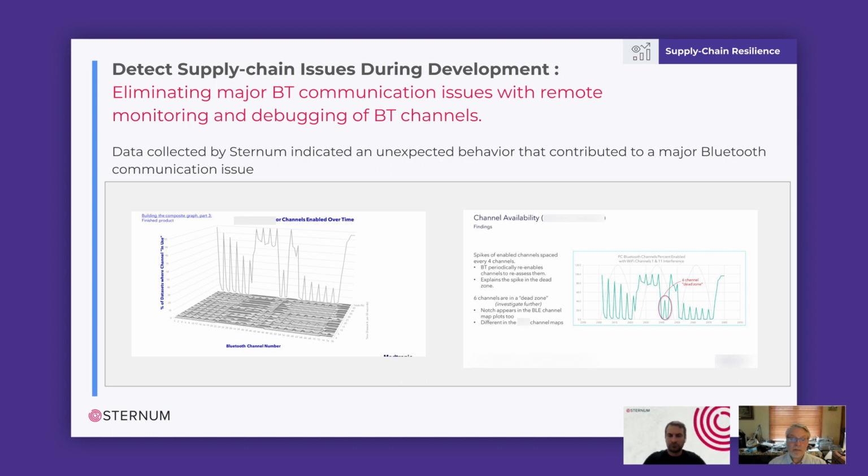And so the patient connector has two simultaneous Bluetooth connections, one to a low energy Bluetooth implant and one to the iPad. And so I would expect the performance between those two products to be equivalent when they're operating in the same environment, but it's not.